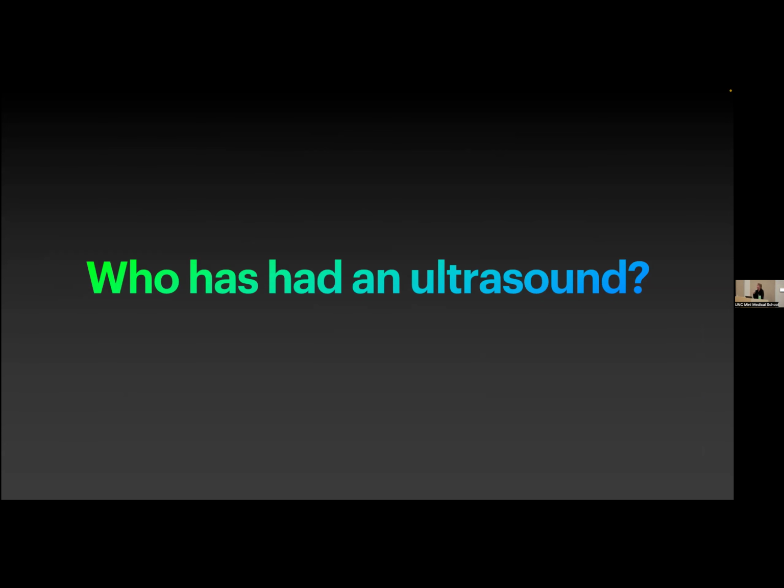The ultrasound is a great first step for a young patient. You're worried about appendicitis. If you can spare them radiation and find an appendix and see it's abnormal, you can make the diagnosis, and then you don't have to have the CT. So it's also a good point of how we can use these modalities together to maybe avoid one. And if we can't, and if you're really sick and you needed a CT, then you could go on to CT after that.